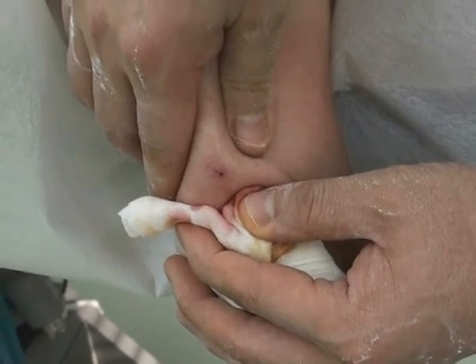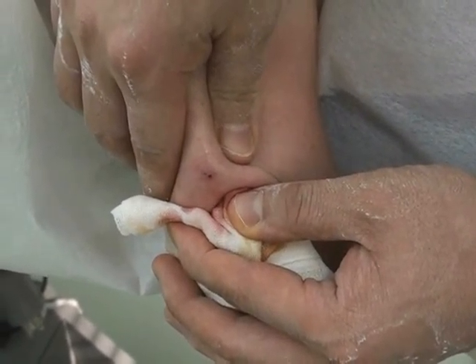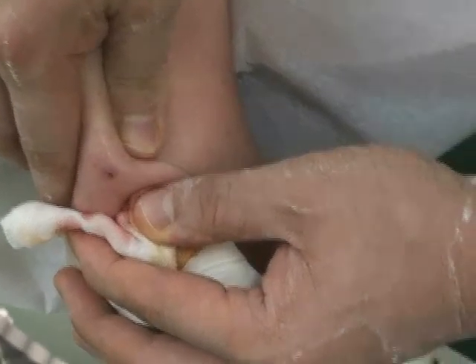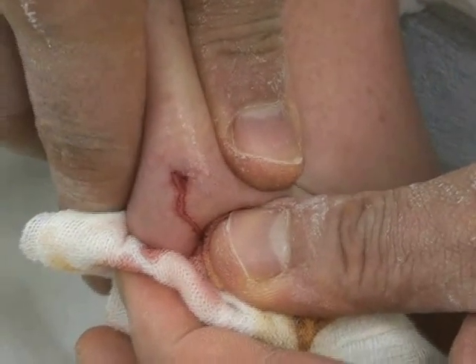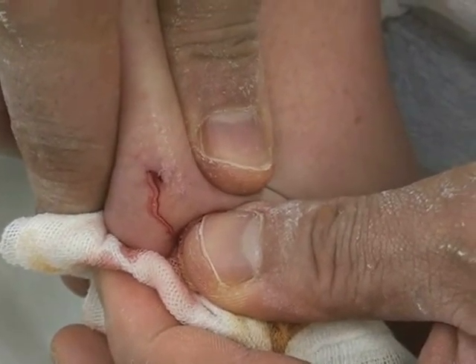From now on, the movie shows a scene immediately after the operation. The friction between the cannula and the skin is small, because the cannula is used here at slow speed compared with conventional laser lipolysis, and the damage at the insertion area of the skin is also small.